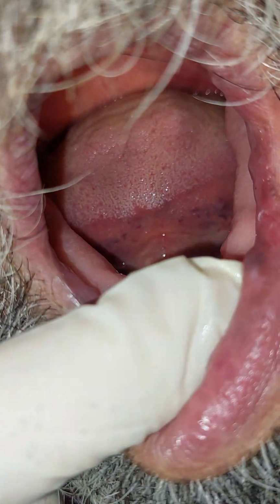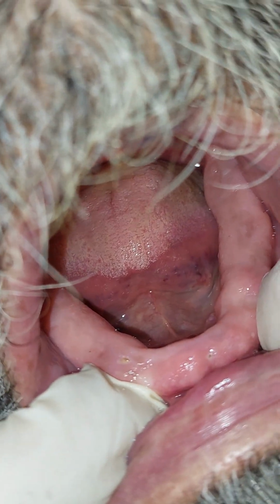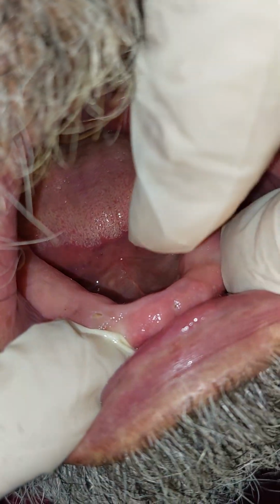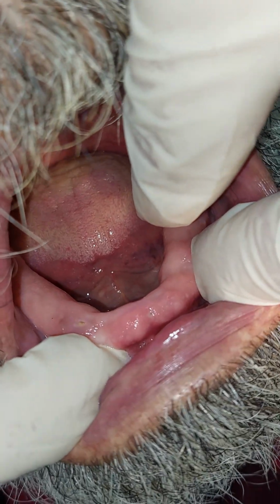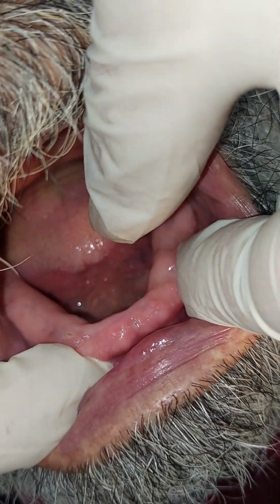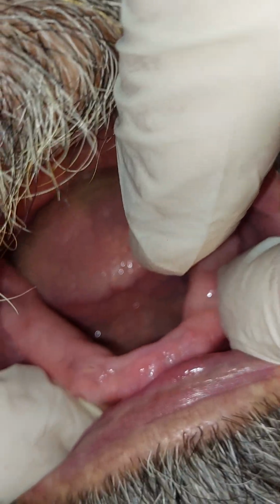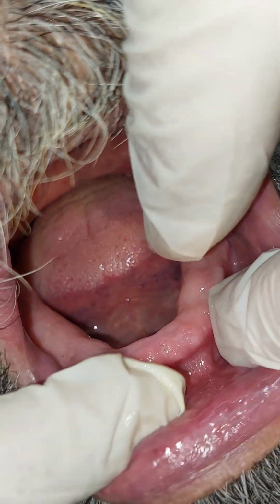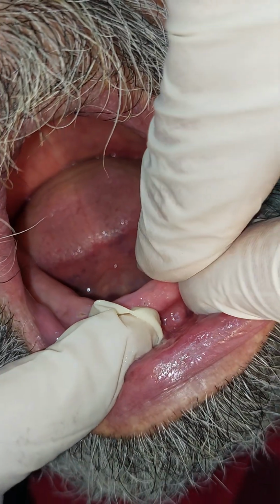What other option do I have? I have an option to change the path of insertion. The material, even, because dentures are solid. Of course, I'm going to change the impression material, yes. But how am I going to do it in the denture? More relief. Why not on the cast, when we take the secondary impression on the cast, I do blockout.